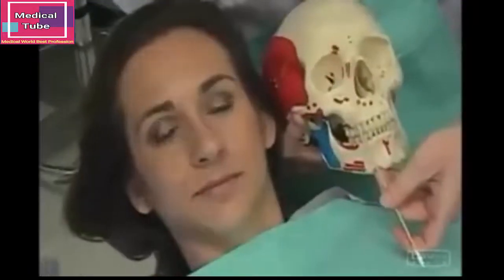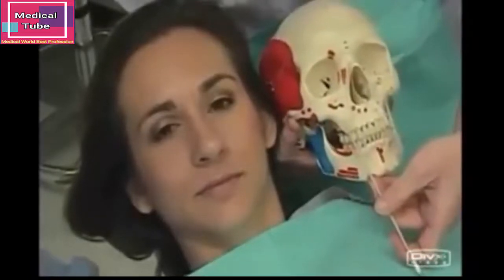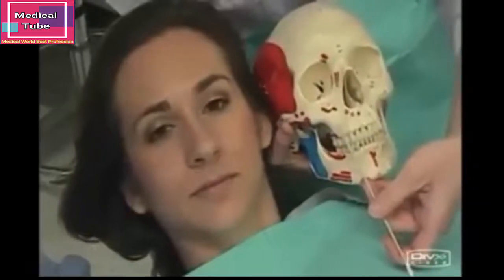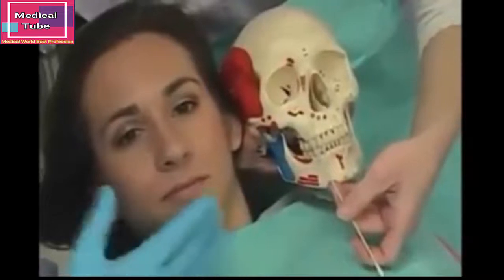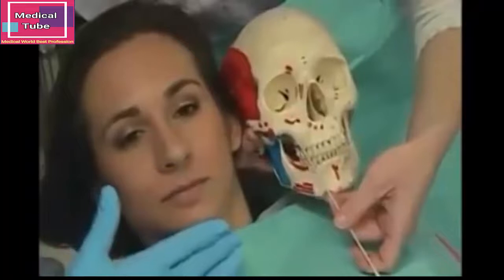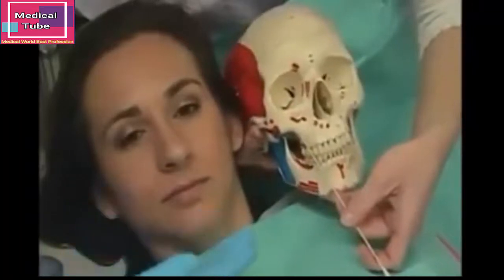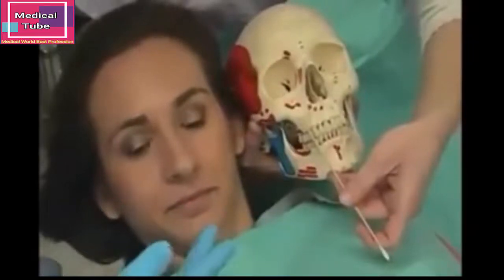Okay, next I would like to demonstrate an elaboration on discovering the landmarks for the infraorbital injection. A good way to start is to have your patient, normally we're going to have Connie with her head kind of straight down. In a normal situation we would have the patient with their head tilted back so as not to interfere with the chest as we're giving the injection.